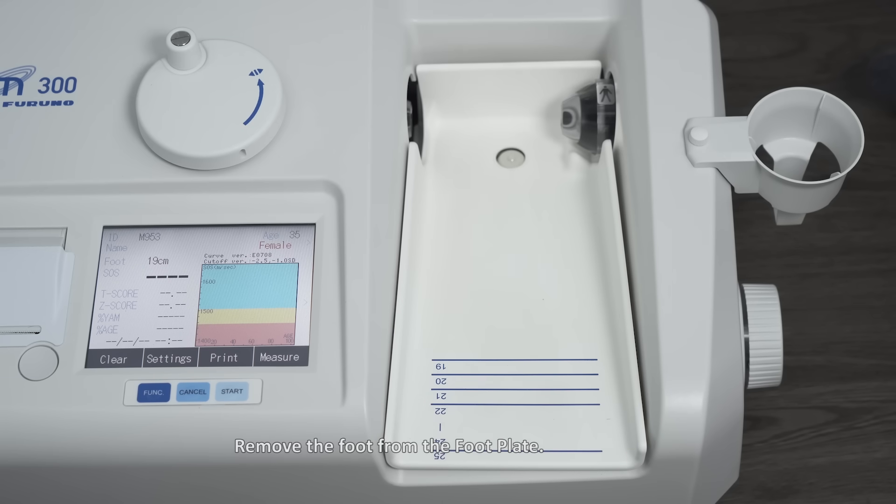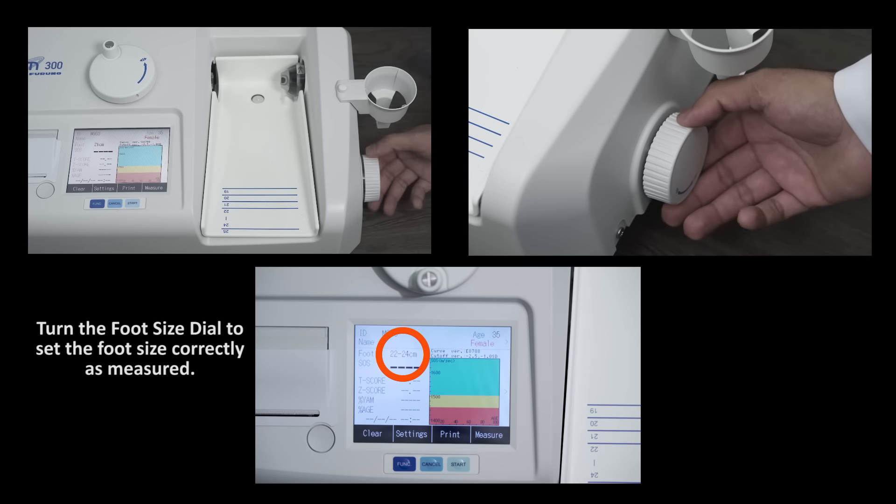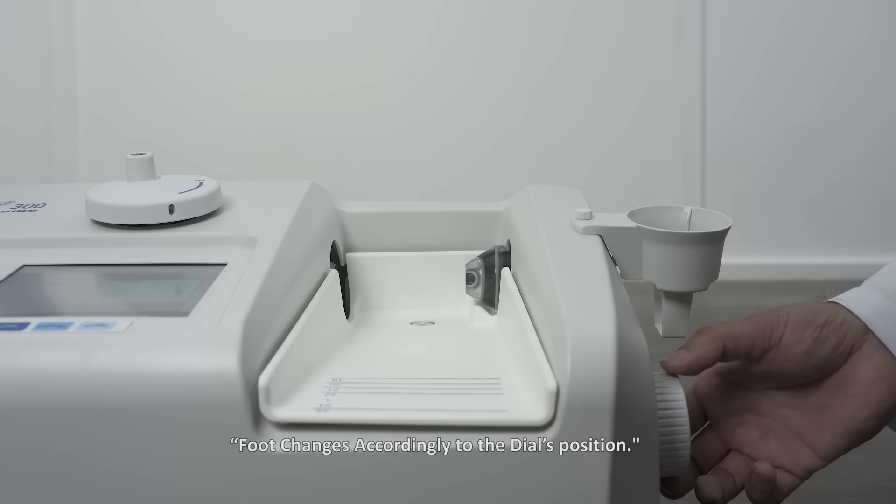Remove the foot from the footplate. Turn the foot size dial and set the foot size correctly as measured. The footplate adjusts accordingly to the dial's position.